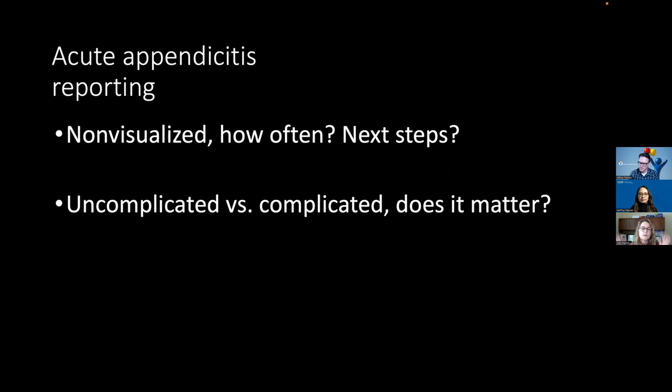And then once we find the appendix in our categories of visualization, if we see it, we have been successful at convincing our surgeons and emergency department physicians that if it's equivocal, repeat the ultrasound, because if we could see it once, odds are it's going to be seen again if there's still clinical concern, and an abnormal appendix will declare itself.